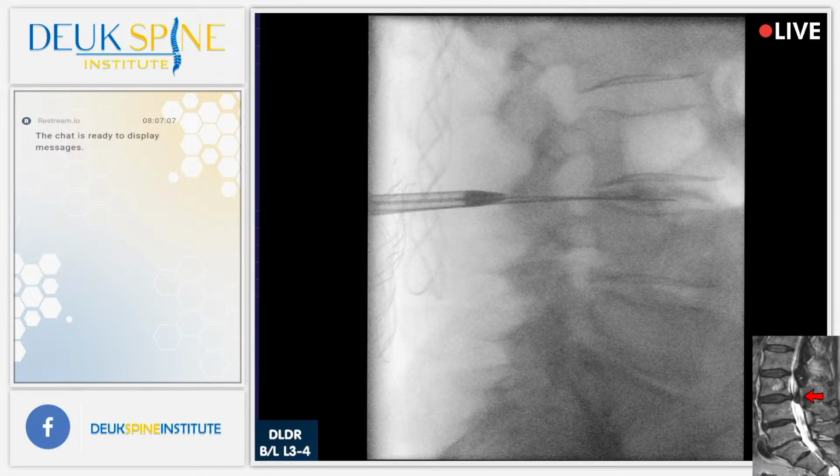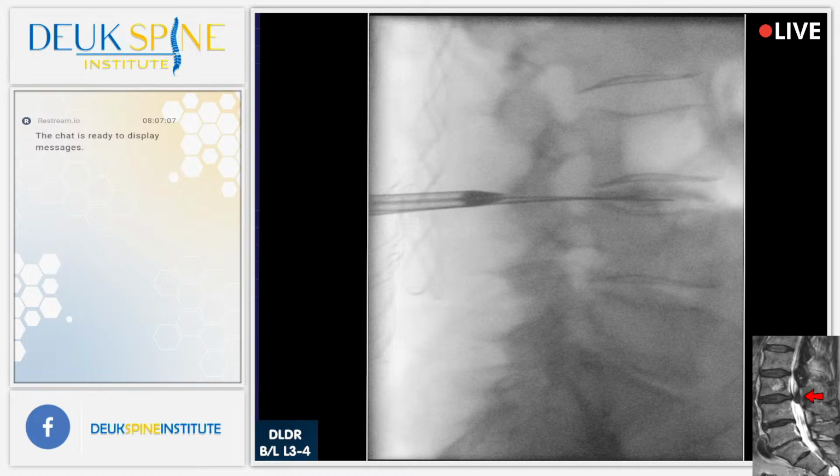All right. Everything's fine. You're doing great, just relax. I need you to count from 1 to 100 out loud. Can you count from 1 to 100? All right, so he's going to sleep right now. We're putting him to sleep. And once he's asleep, we'll proceed. So the part of the surgery with the patient awake is over. I don't need the patient awake anymore.